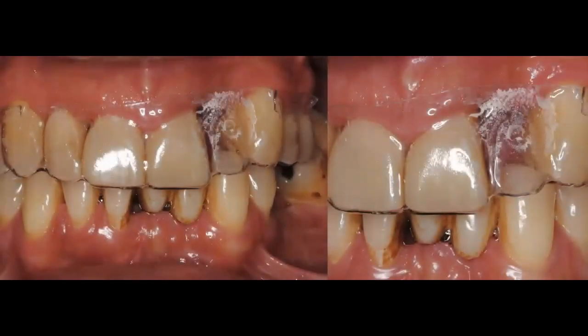There is the completed composite. You can see here where I have added a denture tooth to the site of number 10. And using this model, using this cast, where I have been able to wax up this tooth, now I'm going to go ahead and fabricate a suck down. And again, my first tip is, how can you use a suck down in order for you to place an implant? And this is a very easy technique. This is something that you can do directly in your office, and it's very predictable if you use it the right way.